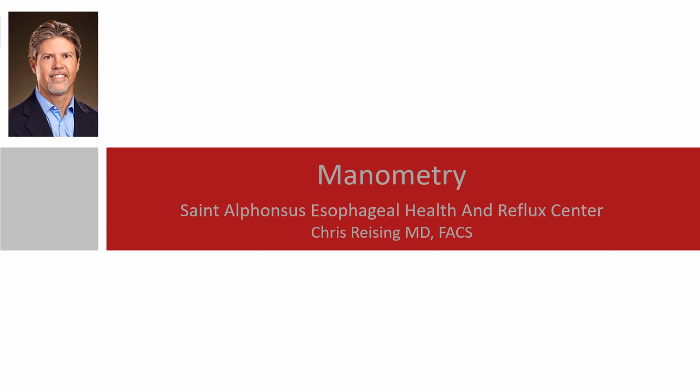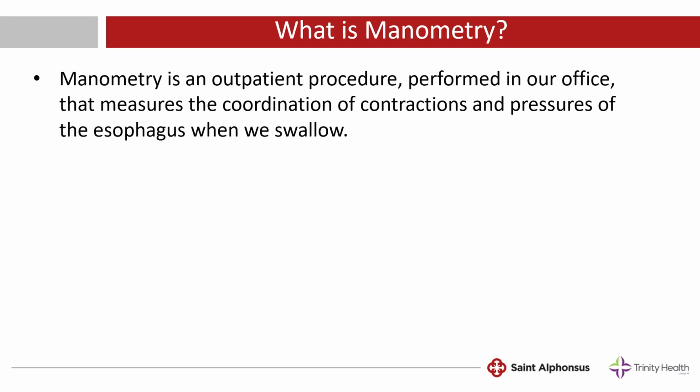Today I'm going to be teaching you about a procedure called manometry. So what is manometry? Well, manometry is an outpatient procedure performed in our office that measures the coordination of contractions and pressures of the esophagus when we swallow.